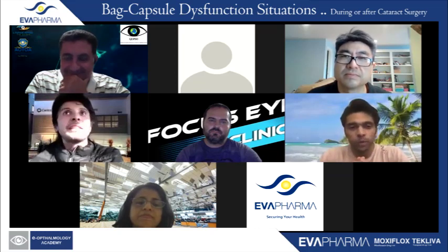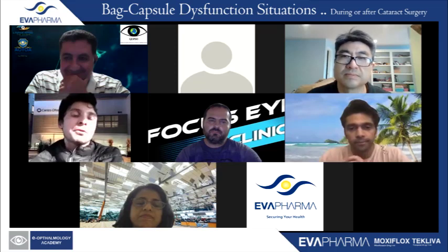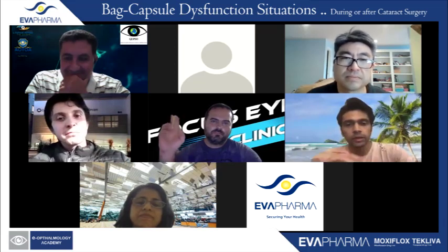It's not fit. Never will fit a 1210. Yeah, that's a brilliant catch. Good catch you caught at home.